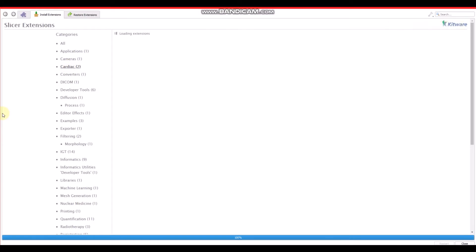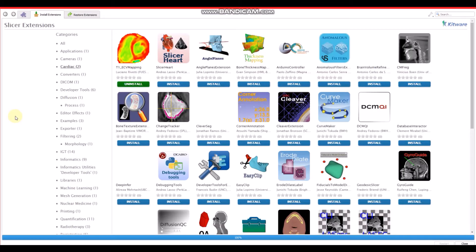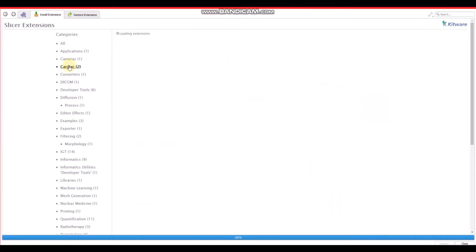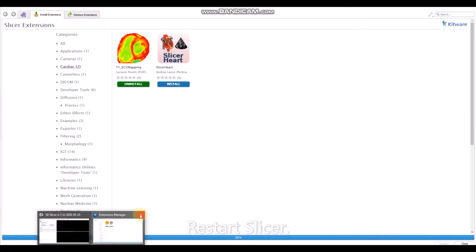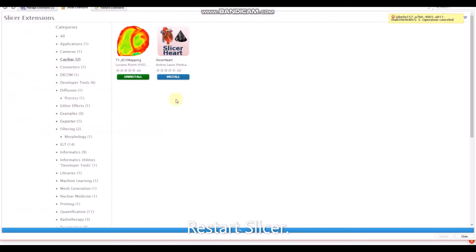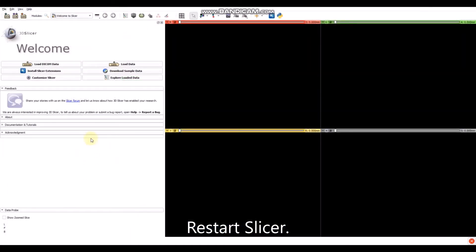It will appear here. Here it is. Click on the cardiac section. Then you will have to click on the install button and it will start downloading. After that, you will have to restart 3DSlicer and then you will be able to start using this module.